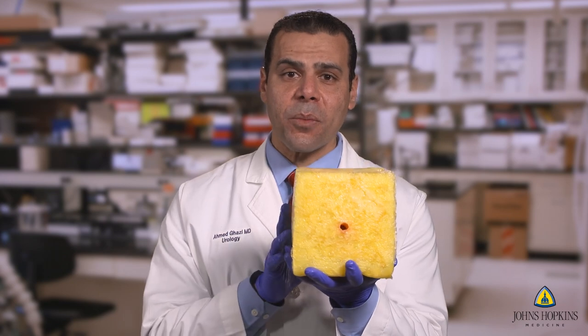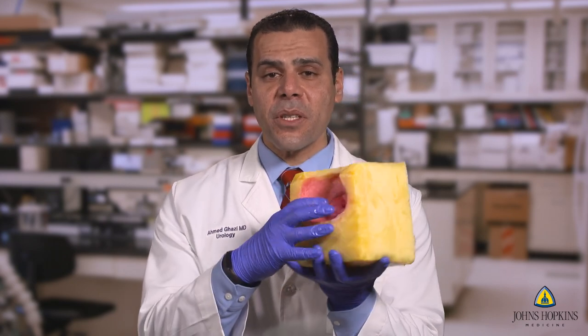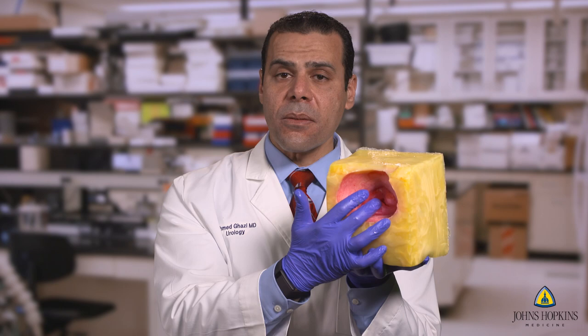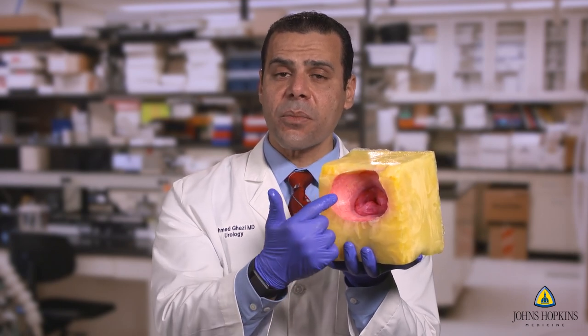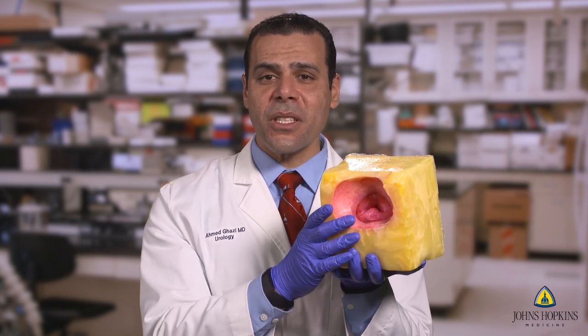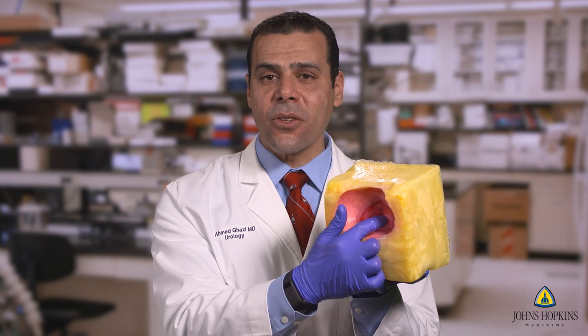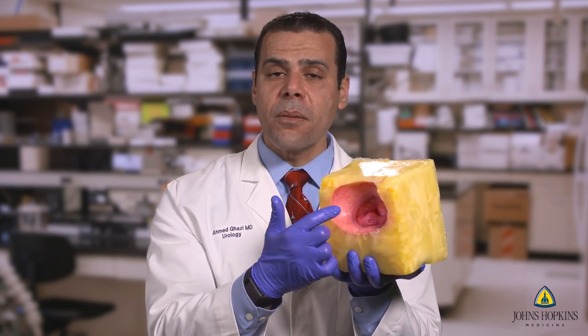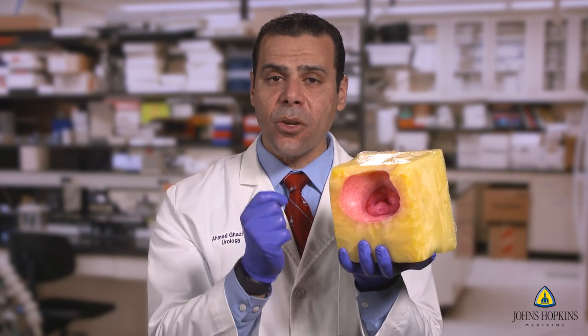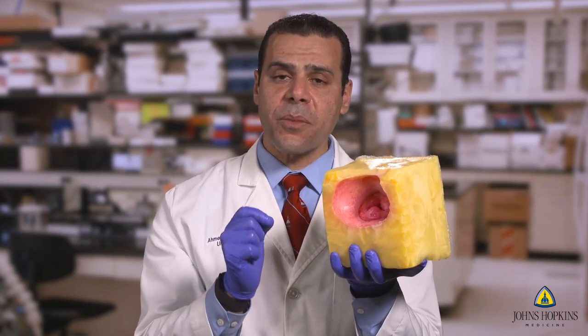From the outside it seems very simple, but truly the value of this model is really on the inside, because this is half a bladder and you can see both ureteric orifices and the ridge, as well as an adenoma with a median lobe and lateral lobes. This is about an 80-gram prostate. A significant amount of research and development was done not only to replicate the texture of the adenoma and the bladder, but also to create that unique plane of dissection between the adenoma and the capsule, which is very unique for this procedure.